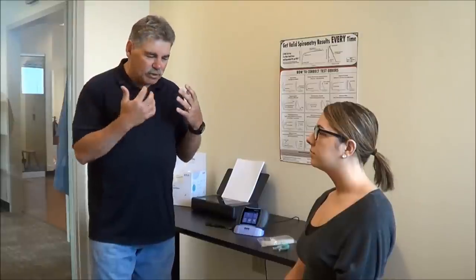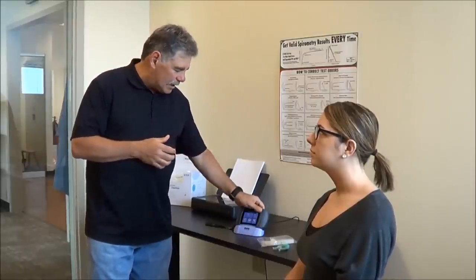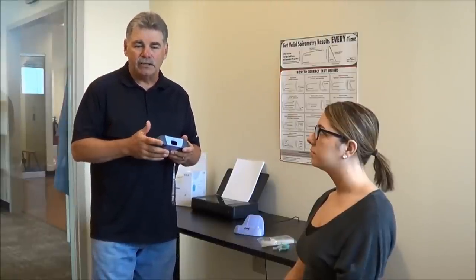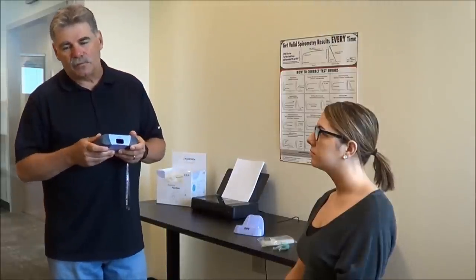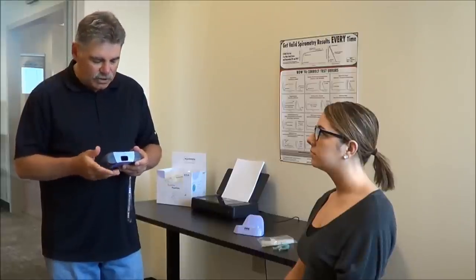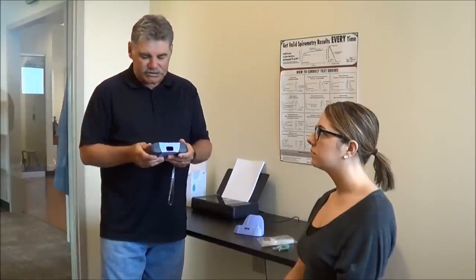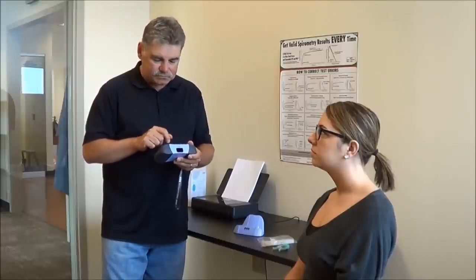So I am going to administer this test to Tina here today. To start the test, in spirometry, it's important that we enter patient information correctly. We use the age, sex, height, and ethnicity for predicted values, so it's important that all that gets entered correctly. To get started, I pick up the device and turn it on. I get a main menu with a bunch of things I can do, and I'm going to choose FVC to start the test.